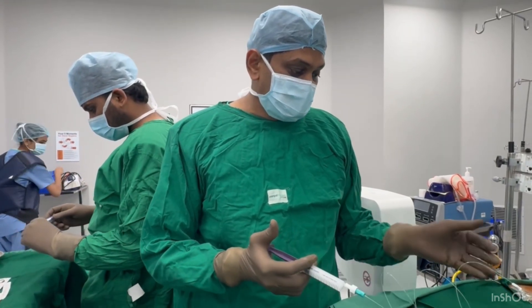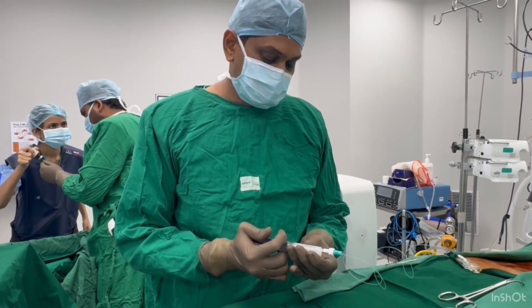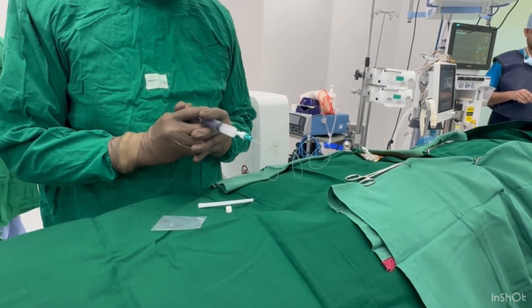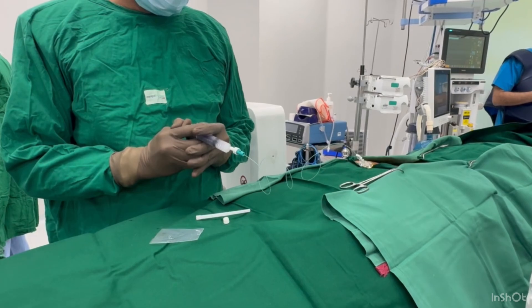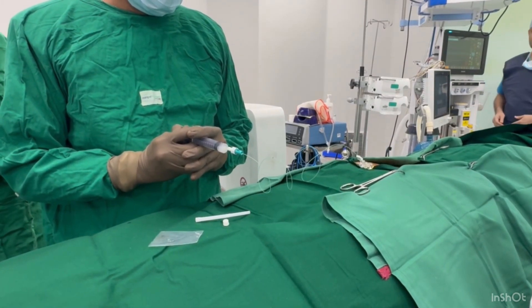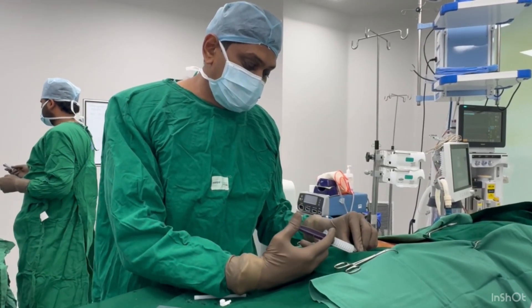Through the epidural catheter, always pull the catheter back a little bit and then start injecting. We are filling the catheter at multiple levels, releasing the solution — now injecting directly from the epidural catheter.